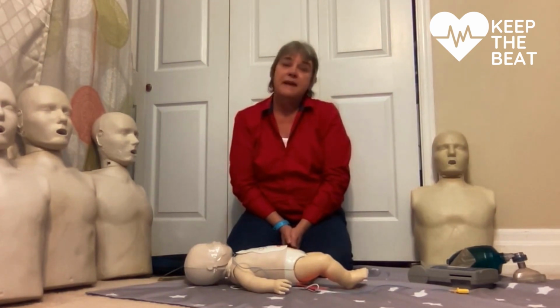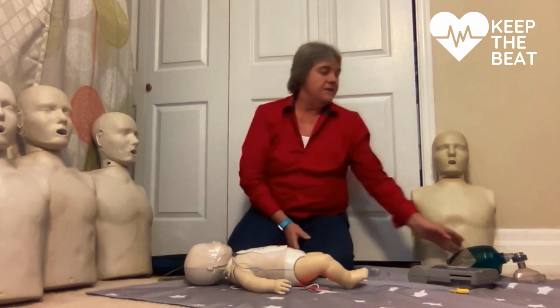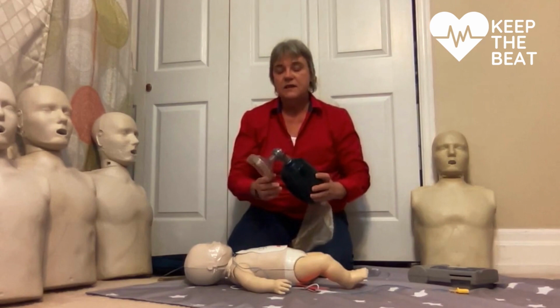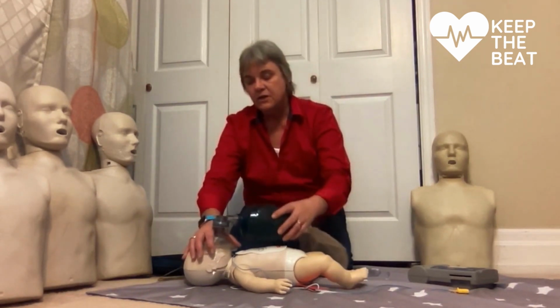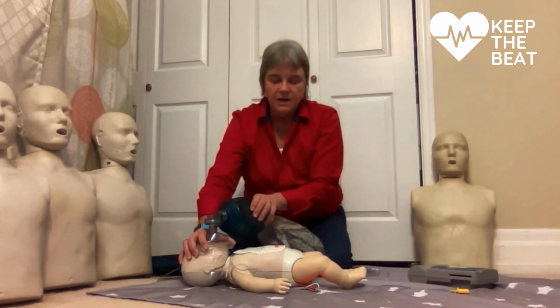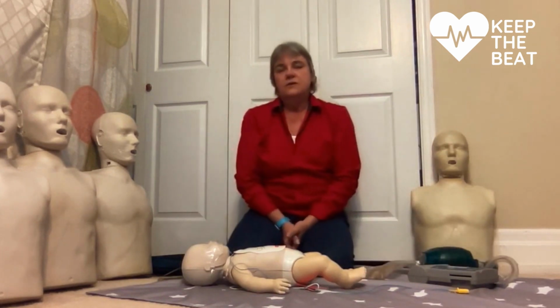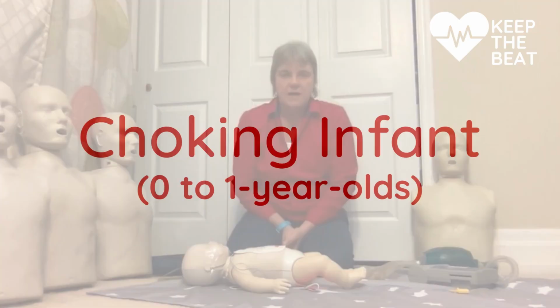You can use the bag valve mask with the infant. It comes in an infant size. If you don't have an infant size, you could take the adult bag valve mask, flip it around, and the pointy part of the mask goes down towards the chin. And I want to deliver little small puffs, watching the chest rise ever so slowly. I go back 5 cycles, and hopefully by then 911 has arrived.